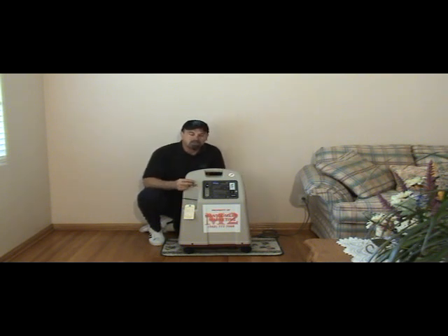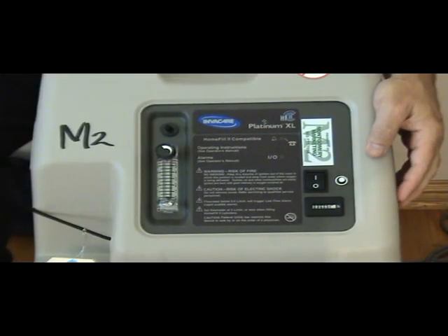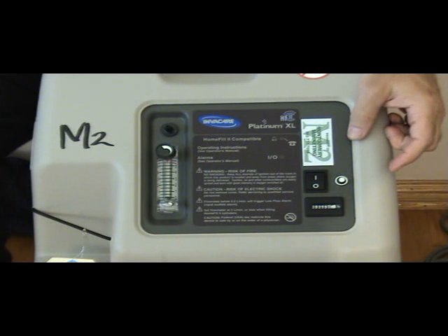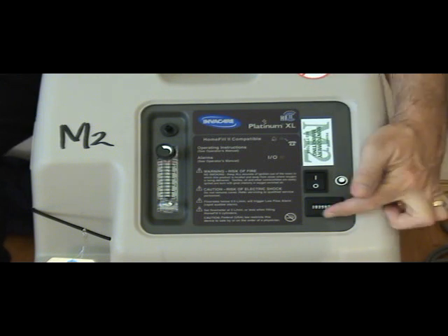So the next thing I'm going to show you is the face of the unit and what each one of those things does. Okay, this is the face of the oxygen concentrator. This is where all the functions are handled from. So I'm going to go over all of these items on here and show you what each one does. Let's start with this one down here.